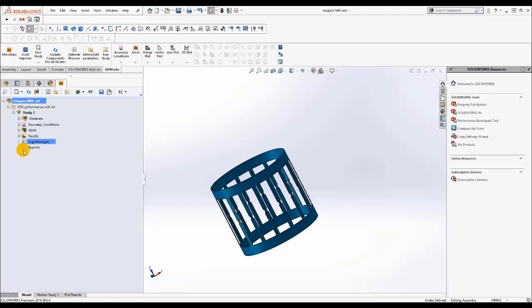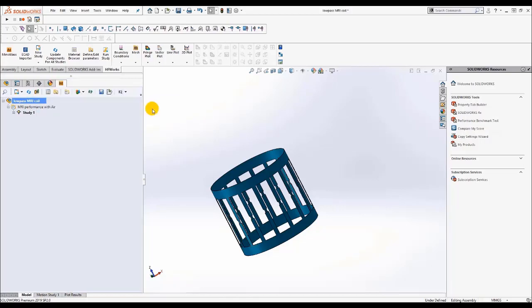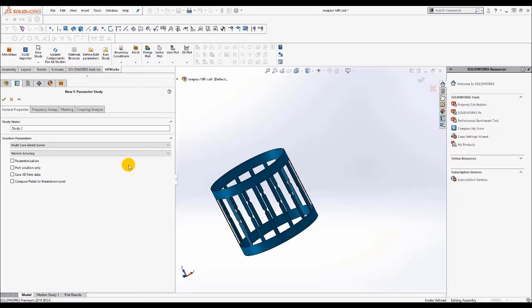We already have a created study here, but let's start from the beginning. Just right click Study and you can choose your study types. As we already mentioned, we have the antenna S-parameter, TDR and the resonance. For our case, we will create a new S-parameter study, just by clicking. A property manager page will be opened.